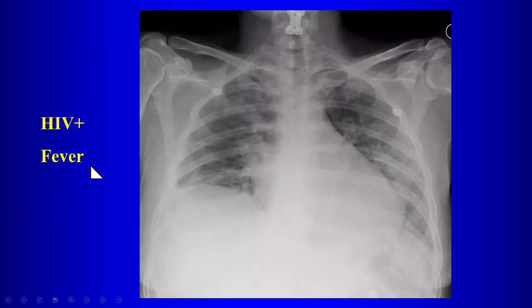HIV positive, fever. We look at the chest radiograph. You notice anything? So the findings are quite vague here, right?